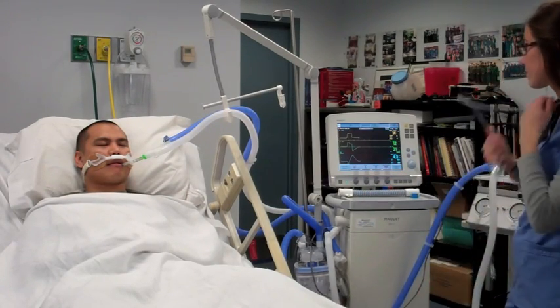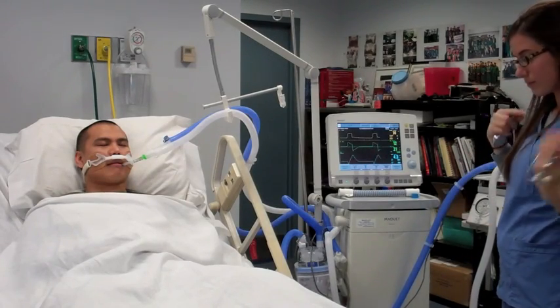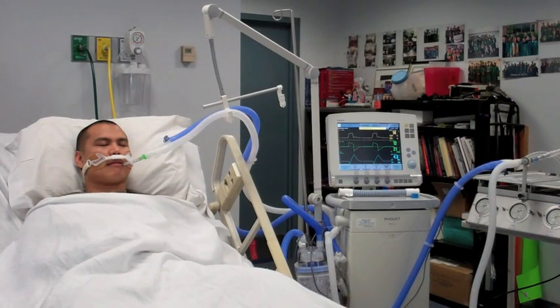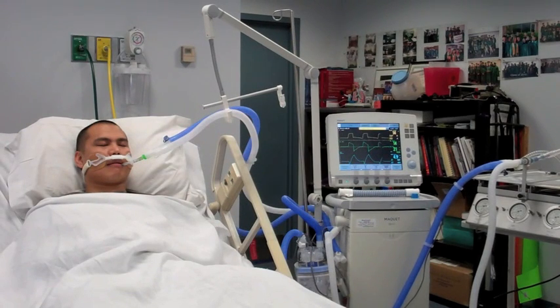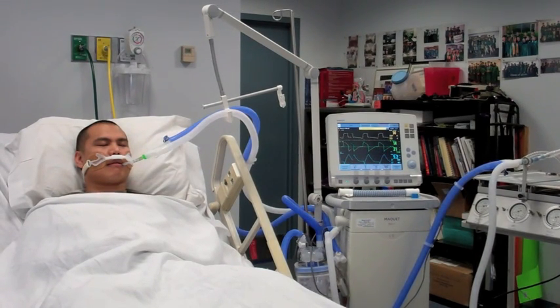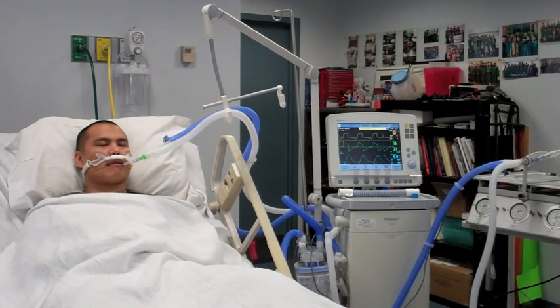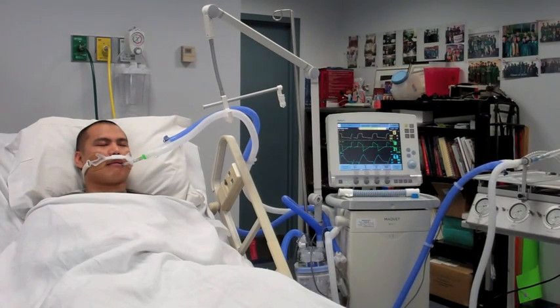Since Mr. Costillo is a candidate for a rapid weaning protocol, Auto Mode seems to be a good choice for this patient. Once the sedation wears off and he starts to feel well enough to assist, the ventilator will switch to a volume support mode after two consecutive patient-initiated breaths. If he starts to experience periods of apnea due to respiratory muscle fatigue or due to the administration of more analgesics, his set PRVC setting will kick in and ventilate for him.